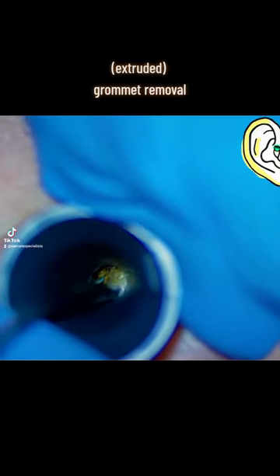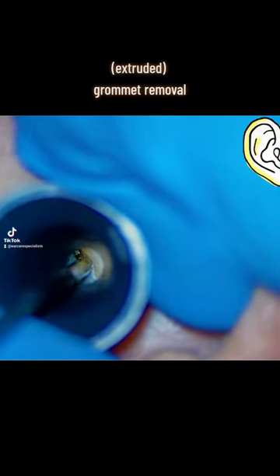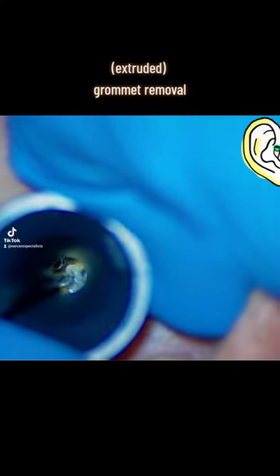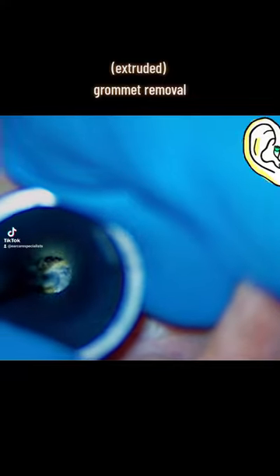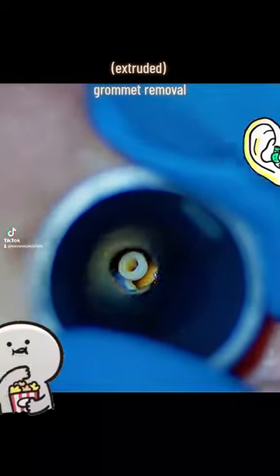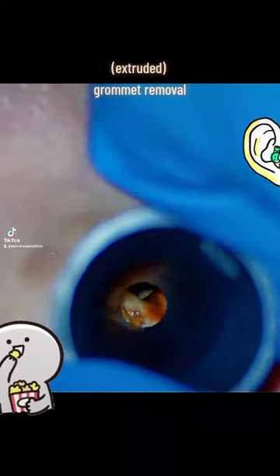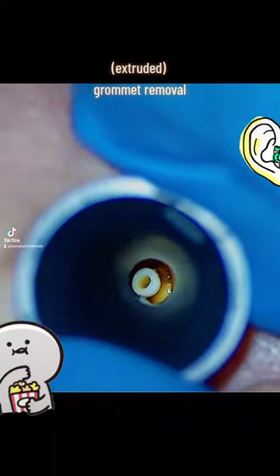We begin by just taking out a little bit of wax from the front of this patient's ear, but this patient has an extruded grommet down in their ear canal. A grommet is a little plastic O-ring, if you like, which is surgically implanted into the patient's eardrum. It's a purposeful perforation and it's used to treat middle ear effusion, or glue ear as we often call it.